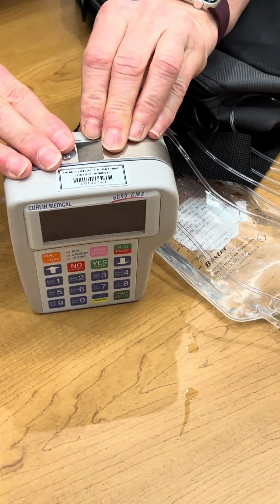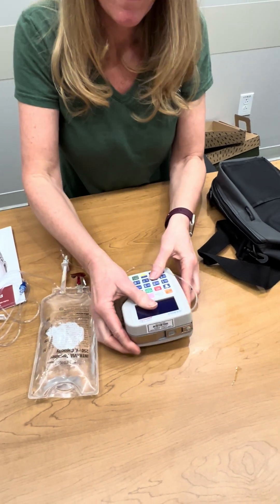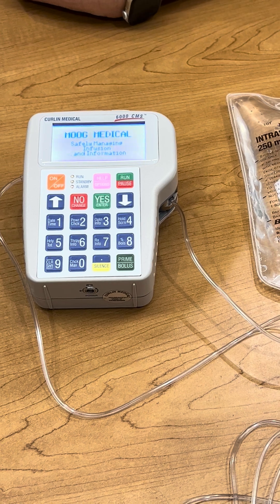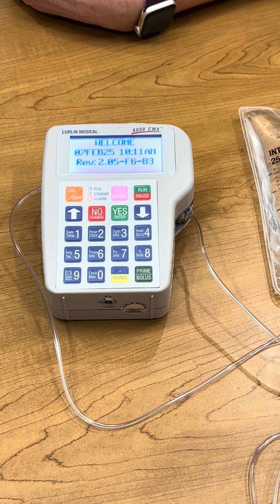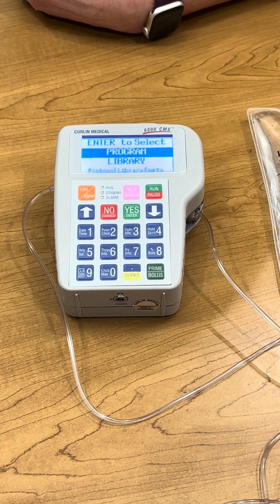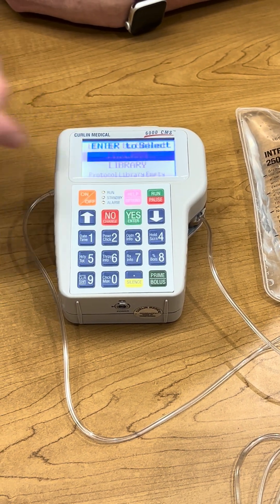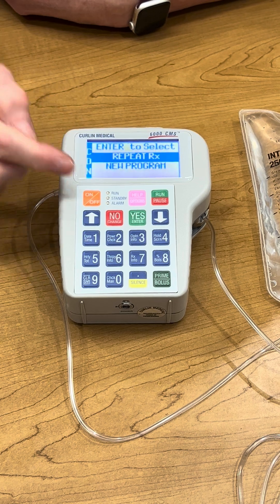I'm going to push down and clip. I'm going to turn the pump on. When you turn the pump on it's going to tell you who makes the pump, then the alarm checks, and then your battery life. The screen says 'enter to select' and it's highlighted on 'program' — that's what we always want. Yes is how we proceed, so yes is the enter button. It shows 'RepeatRx' — that's a brand new bag, which is what we have — so I'm going to say yes.